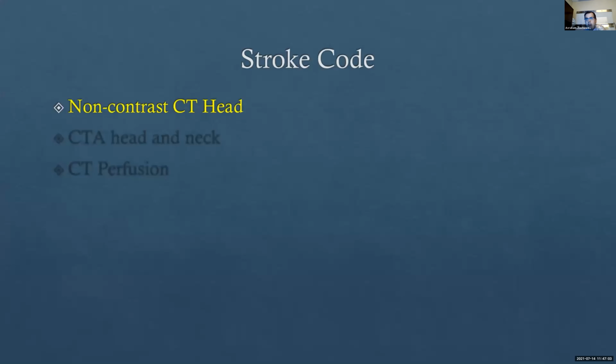And for those who were at Dr. Promnick's lecture last week, CT is, for short explanation, basically a 3D X-ray. And we're doing that of the head, getting these images. We don't use IV dye. We then do CTA, where we give IV contrast dye to look at the vessels, the arteries in the neck and the brain. And then we're going to do something called CT perfusion.